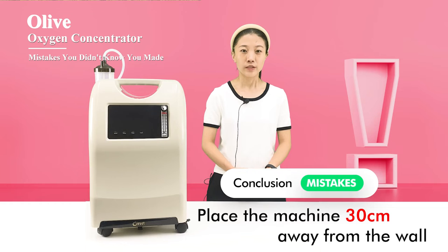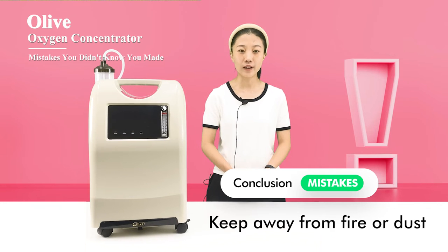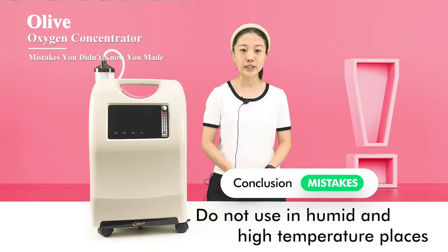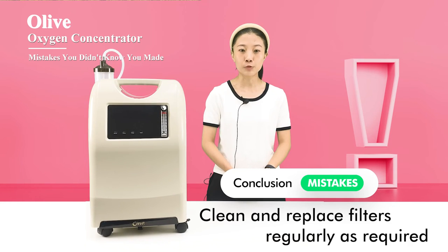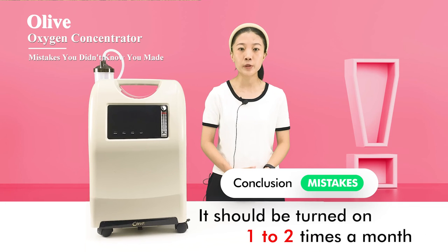To avoid these mistakes: Place the machine 30 cm away from the wall and do not place it on the carpet. Keep away from fire or dust, and do not use in humid and high-temperature places. Clean and replace filters regularly as required. If the machine is not used for a long time, it should be turned on one to two times a month.